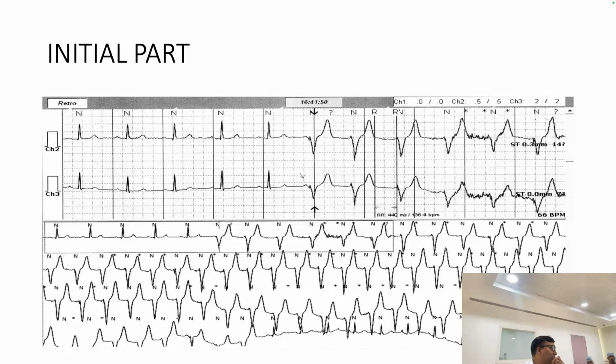So this was also a learning for me. I was also not knowing this. Every device has a different way of measurement. The important part is, you can see here it is started and ending. In electrophysiology, or we can say in arrhythmia, the two parts are very important: how it is started and how it ends. If you are not able to capture the starting part, try to capture the ending part. You can see the ending part so nicely. It means normal rhythm is going and in between the pacing is coming. So what are the possibilities?